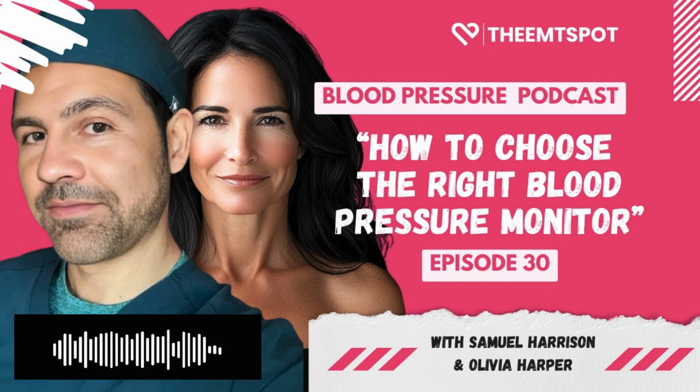I like that analogy. So what are the pros and cons of each? Well, with the manual ones, you're really relying on your skills. You have to be able to read that little gauge. They can be accurate, but only in trained hands. I can see how that would be tricky. Then you've got the aneroid monitors, which are simple to use, but you have to make sure they're calibrated correctly. What does that even mean? It basically means making sure they're still giving you accurate readings, and you have to do that every so often. So kind of high maintenance. A little bit, but they're usually pretty reliable.